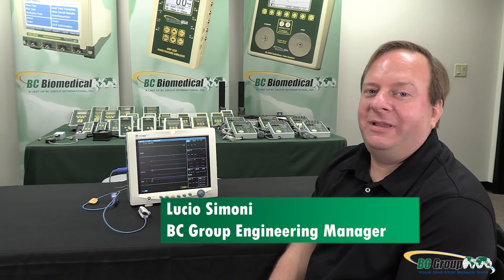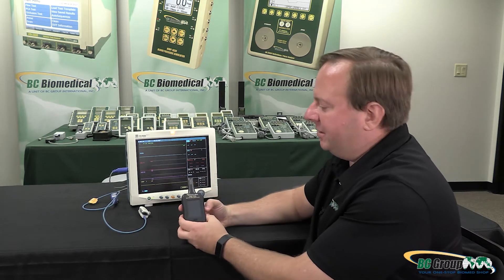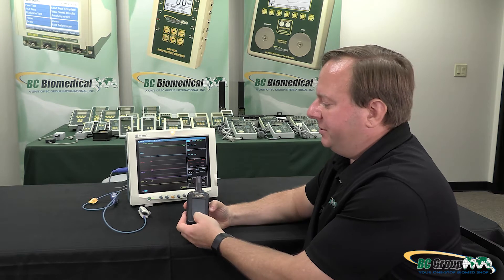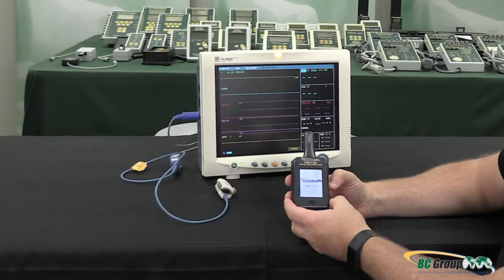Hi, my name is Lucio Simone. I'm the engineering manager for BC Group International. In this video we will be discussing the FSX 1101, all of its features and functions. This is our latest digital SpO2 simulator.